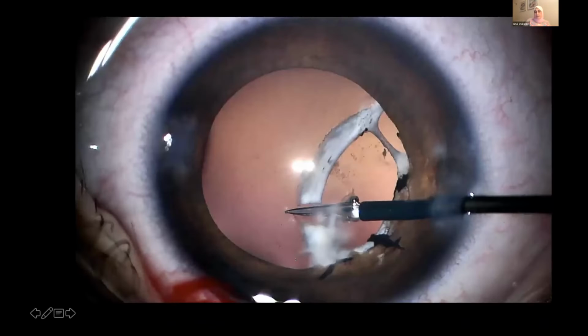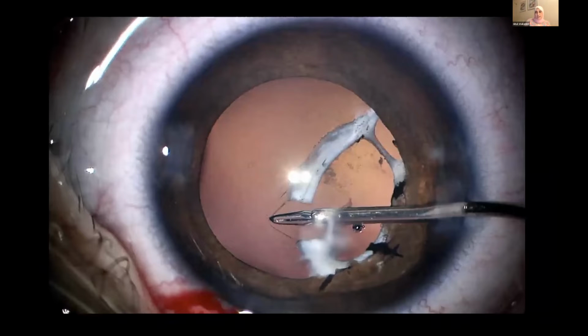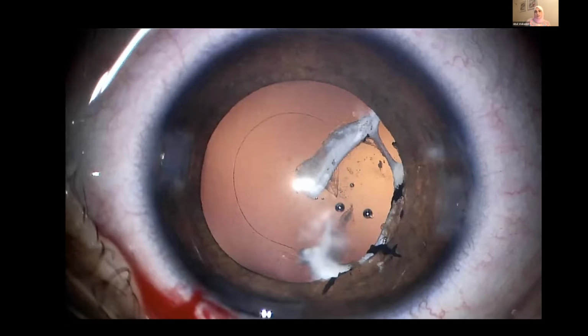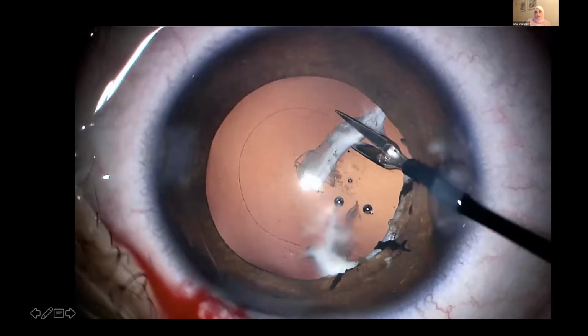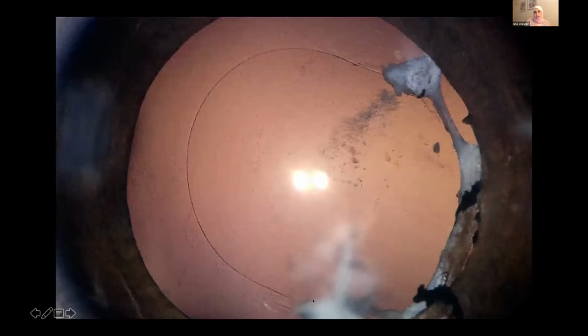How to deal with it? Through the side port, we enter with 23 gauge micro scissors. We cut the fibrotic edge, and then we go through the side port with a 25 gauge rhexis, and we make the anterior capsulorhexis until we reach this fibrotic part. We enter again with the side port and cut this fibrotic edge. So we are left with a beautiful curvilinear anterior capsulorhexis. Here with magnification, it is partially transparent capsule and partially fibrotic, but it is continuous. And we can continue with the capsulorhexis, anterior vitrectomy, and then injection of the intraocular lens beautifully inside the capsular bag between the two rhexes.